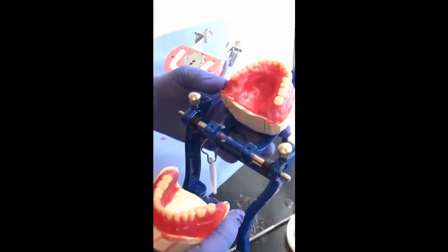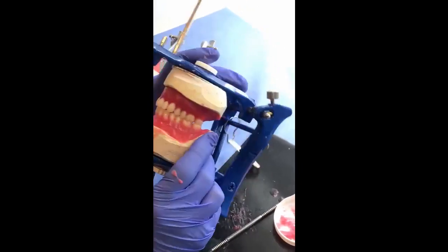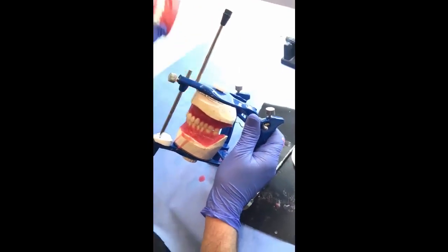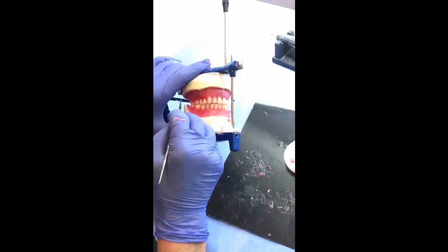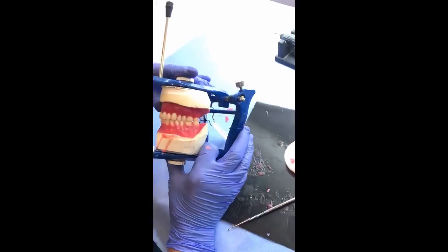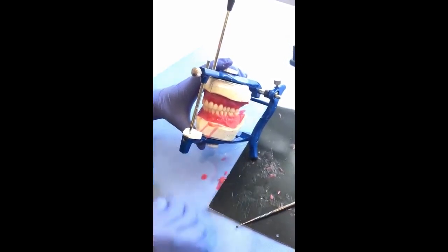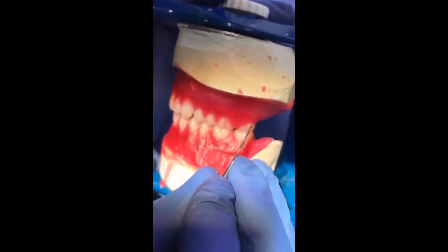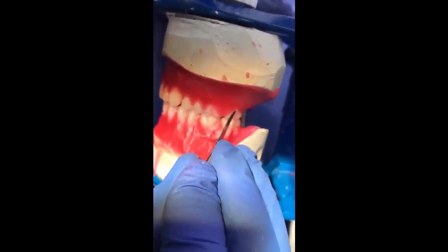As you see here, we have completed the stage of adding the bulk of wax needed, and we have to check the occlusion every now and then to make sure that the teeth did not move while adding the wax to the base of the denture. Now we are going to proceed to the next step in the waxing up. The second step after adding the wax is to create a ledge around the teeth.